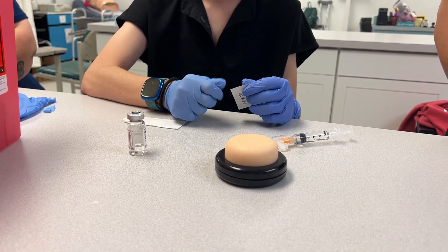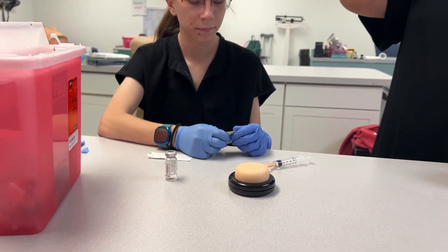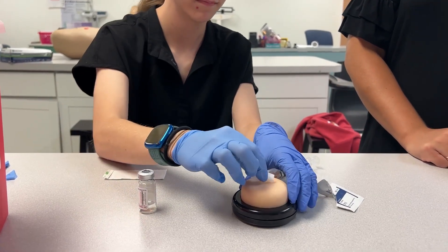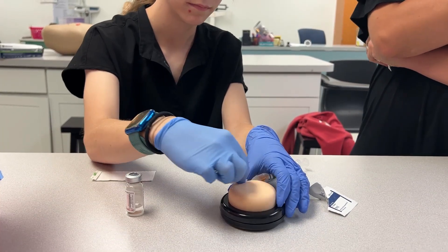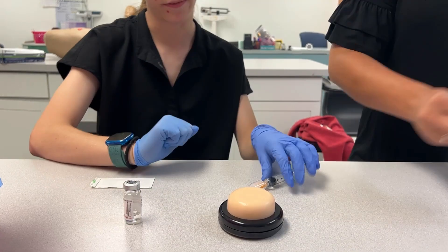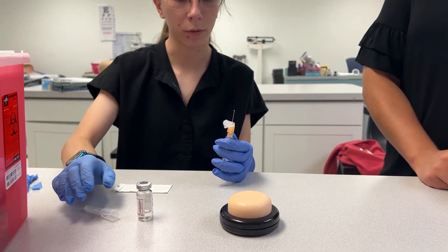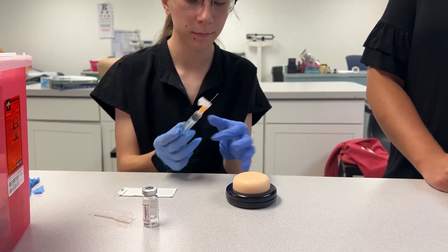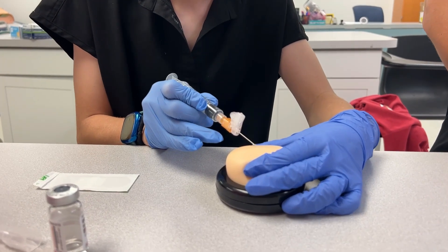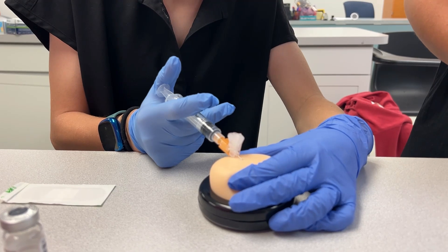We verified our patient already. We're going to make sure our placement is correct — we're going to give this in the back of the lateral arm. Go ahead and wipe your patient off. For a subcutaneous injection for MMR in the lateral arm, what angle are we giving this? She can pinch the skin a little bit, make sure her bevel's up — 45 degrees. Good job, go all the way in.